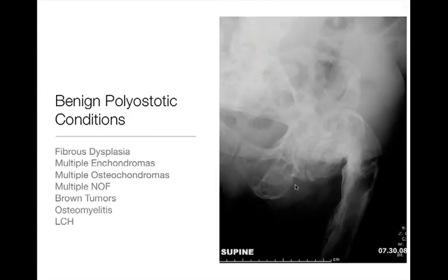Here is another image of polyostatic fibrous dysplasia. It's affecting multiple bones in the pelvis and also the proximal femur. The proximal femur is a favorite location for fibrous dysplasia, giving one of the classic shepherd's crook deformities — the femur is bowed and not normal in morphology, looking like an old gnarled wooden stick.